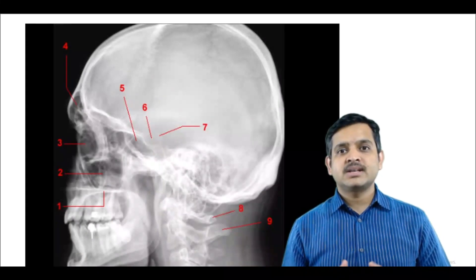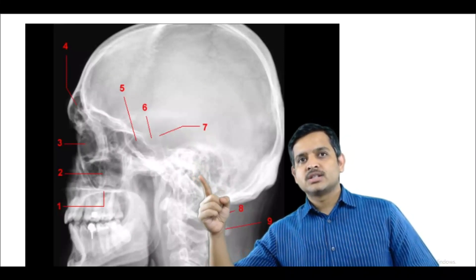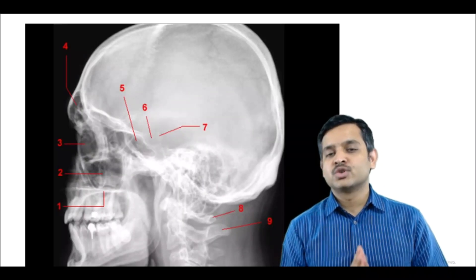This is a lateral radiograph where you could see the sella turcica, sphenoid sinus below it and mastoid air cells. A very useful radiograph.